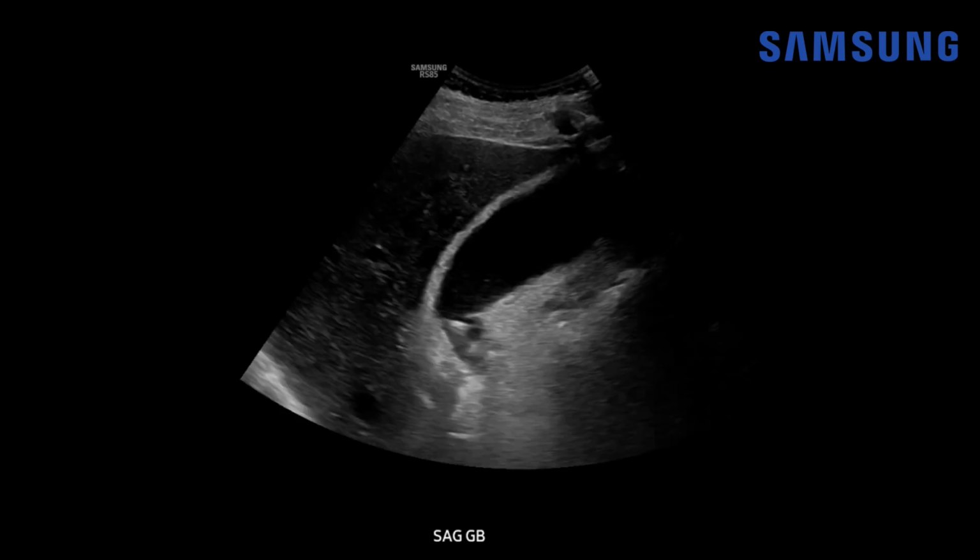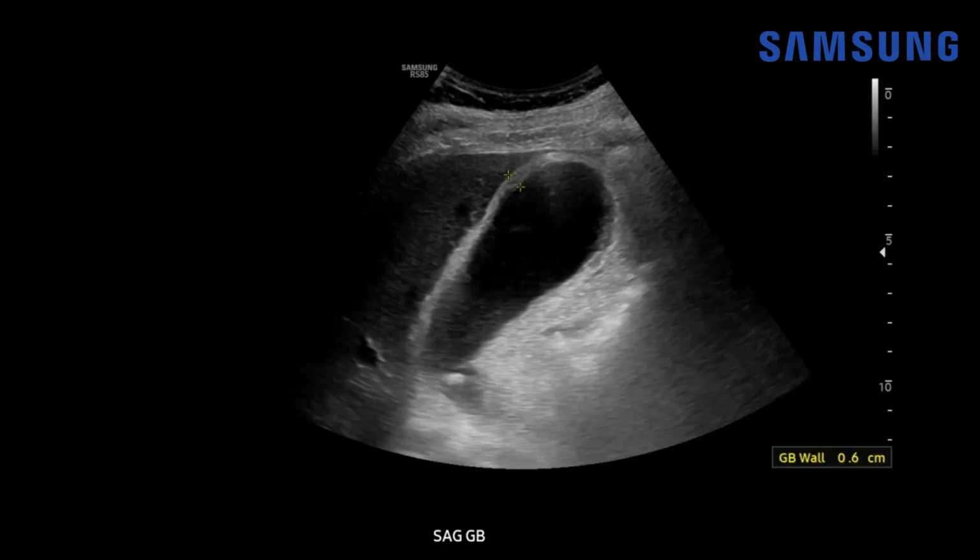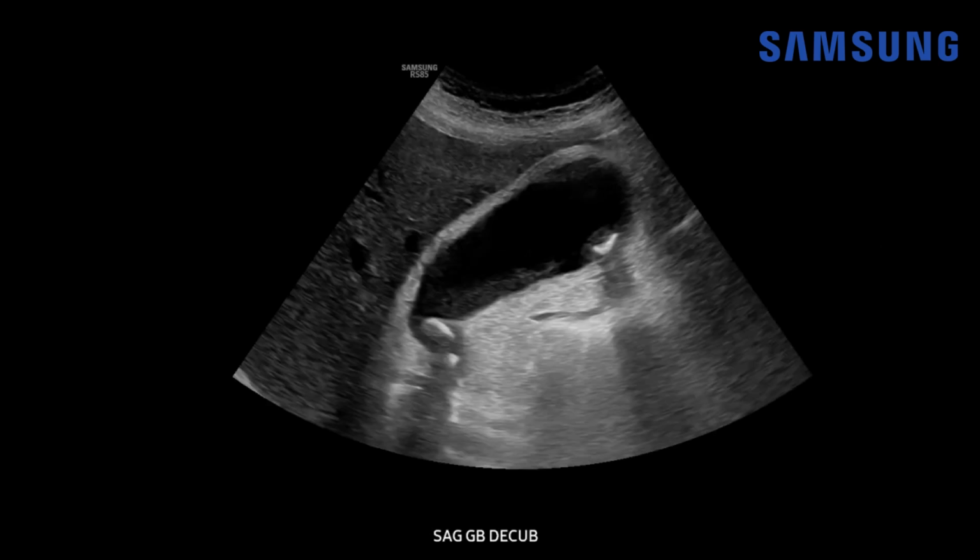Let's look further. Notice that we see some stones in the gallbladder neck approaching the cystic duct, and that wall is quite thickened. It measures at least 0.6 centimeters. That's more than 3 millimeters. Now, when we change the patient to the decubitus position, notice that we have these fixed stones within the gallbladder neck, so they are impacted.